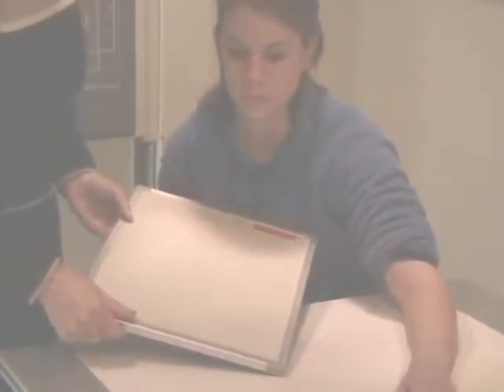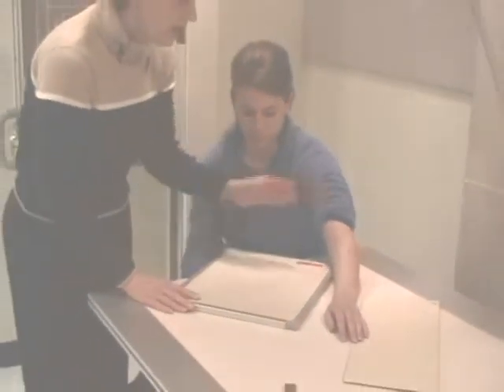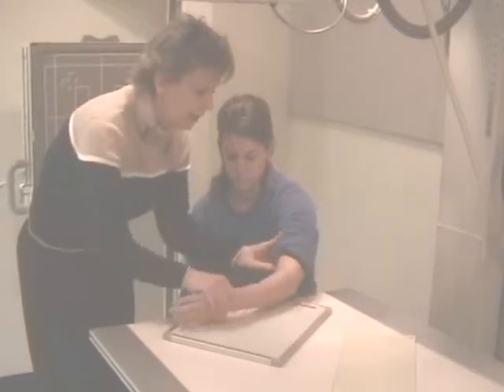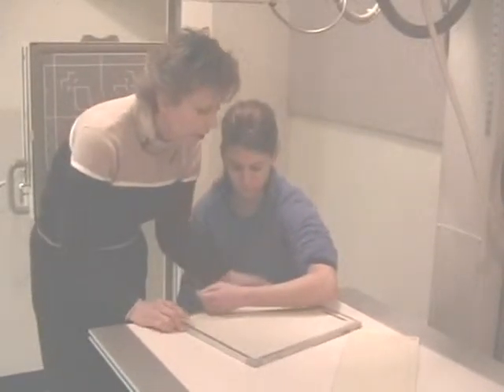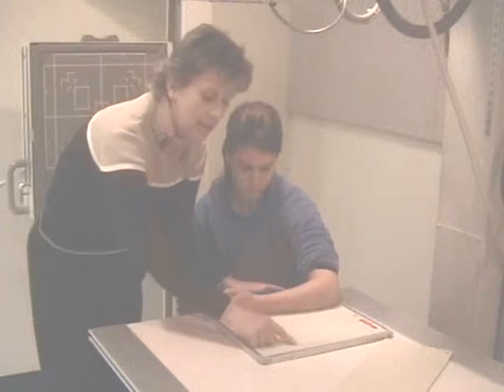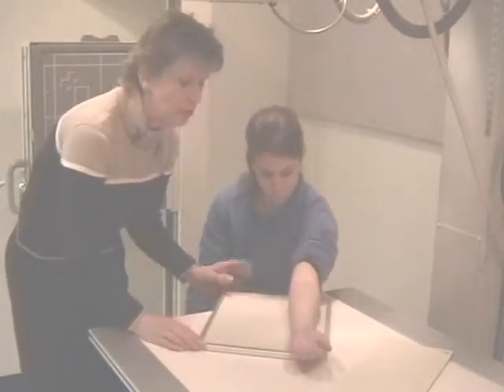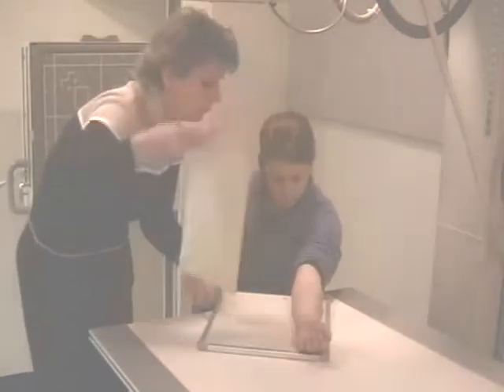Okay? So let's start with a distal forearm today. And it's a right arm. And when my patient's arm is bent, like that, I have to vision the humerus coming off, and I'm going to put my lateral on this side so the humerus will come off. That means the AP would be on this side. And my habit has been to perform my APs first. So I will continue with that habit.